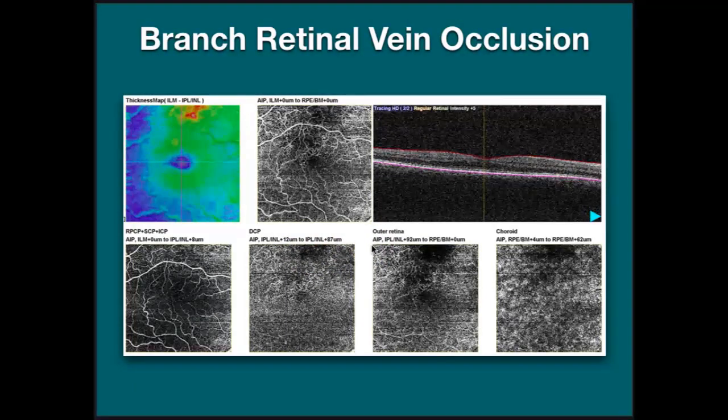Fortunately, she hasn't developed any neovascularization, and with such a small area of capillary dropout, I'm happy to keep monitoring her, looking for any signs of future neovascularization.